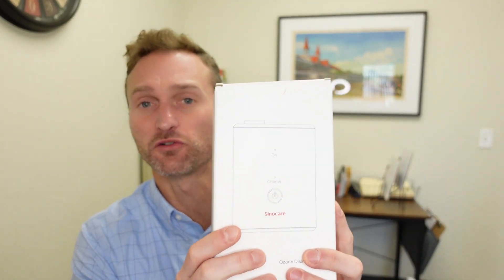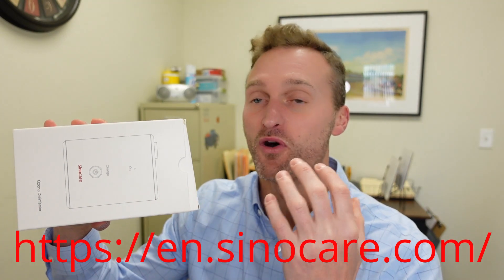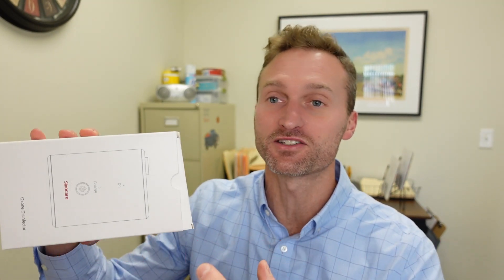I want to show them to you and then describe exactly how we're going to give all 50 of these away. It comes in this nice little box — they sent us about 50. I have a whole bunch of boxes, three big boxes with a whole bunch of these inside.